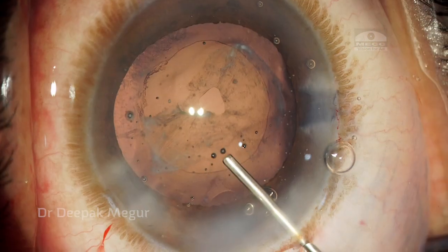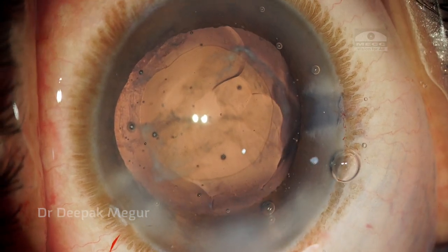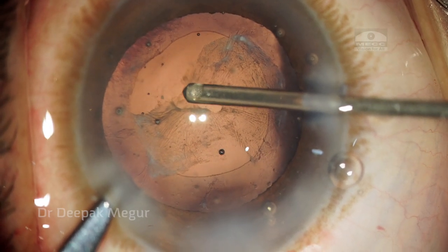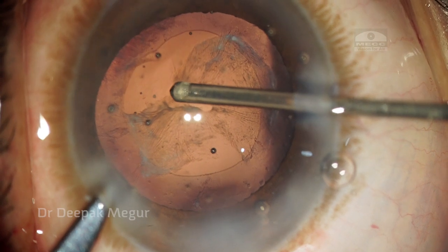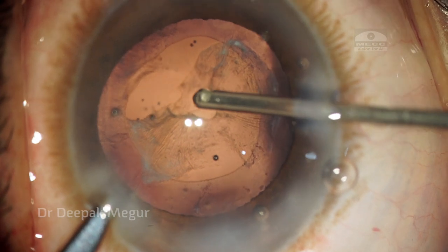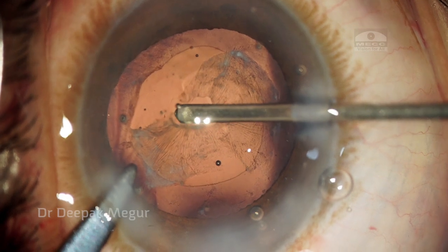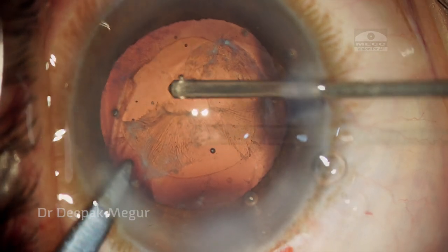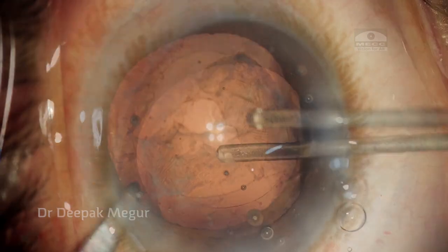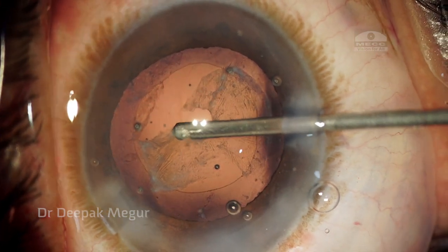The usual source of air bubbles is from the OVD syringes. I put a little bit more OVD to clear them. The entire process is done without using any irrigation. I am just trying to enlarge the opening. My goal is to enlarge it to around 2 to 2.5 mm in the center of the visual axis — though in a dilated pupil it is quite difficult to predict exactly. Once I have achieved my desired size of the opening, I think this should be enough.